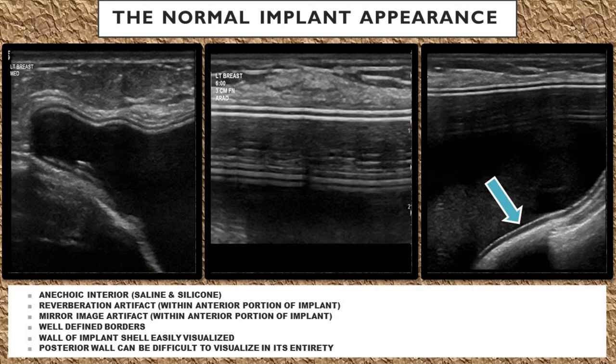It's going to have well-defined borders. The wall of the implant shell will be easily visualized in the anterior portion of the implant, and the posterior wall of the implant can be really difficult to visualize in its entirety.